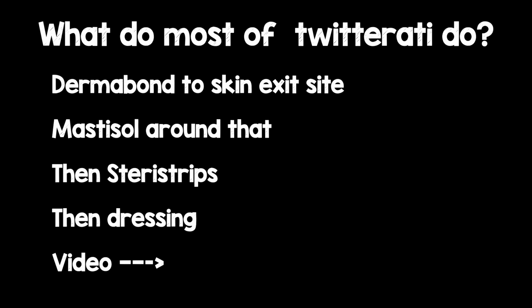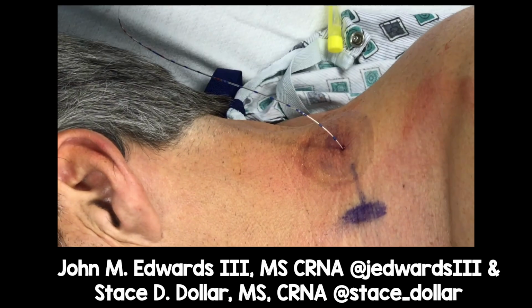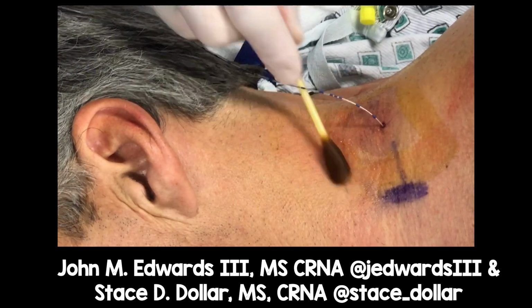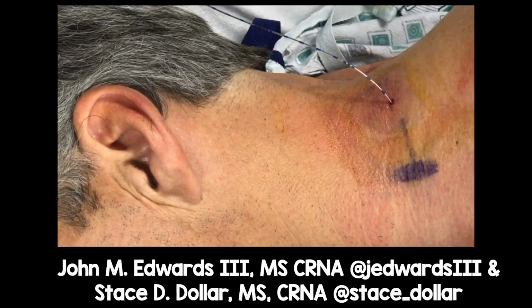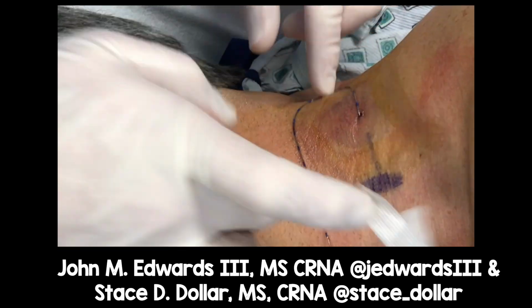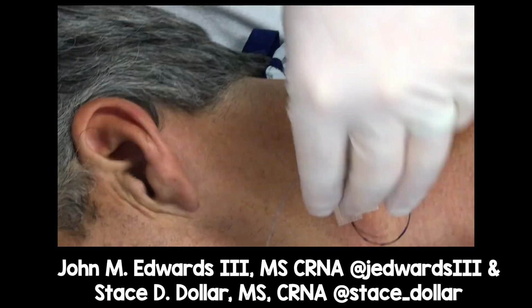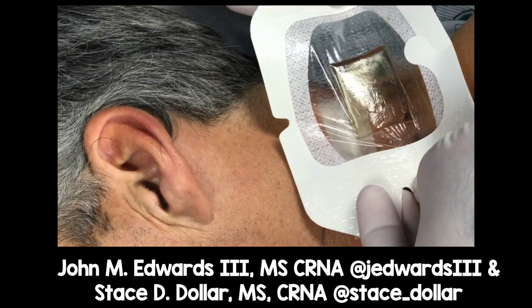So here we go, let's have a look at this. There you go, there's the exit site with some Dermabond around it. There's an interscalene catheter. Having done that, they're then going to apply some Mastisol around that exit site, and having applied that Mastisol, they're going to make sure they dry it so it's nice and tacky. Then they secure the catheter in a particular location here and use Steristrips to secure that in place on top of the Mastisol, which is also a bit more adhesive, with an extra redundant coil in that.